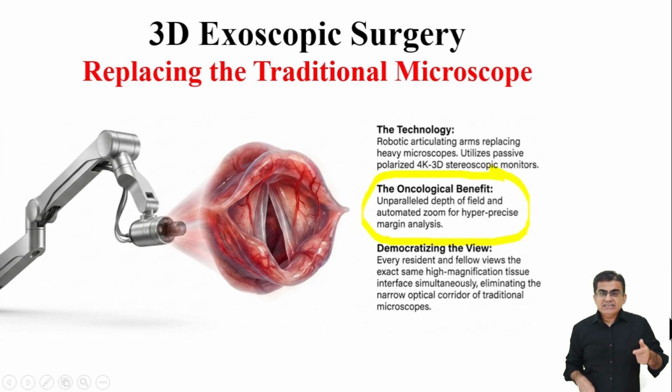Now every single resident and fellow in the room simply wears these passive polarized glasses. You will all see that exact same high magnification tissue interface simultaneously on the large digital screen. This completely eliminates the isolated optical corridor and vastly improves how we teach this highly complex surgery.